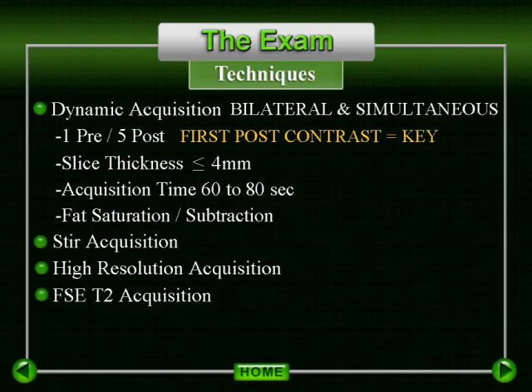We did encounter an isolated incidence of a mucinous cancer, which on T2-weighted imaging appeared to demonstrate a classic reniform configuration with a central hyperintense hilum of what we assumed was fat. In reality, this appears to have been related to mucin or other T2 hyperintense material centrally within the tumor. Immediately following this case, we subsequently began orthogonal high-resolution imaging with fast-spin echo T1-weighted, non-fat saturated pulse sequences. We do still utilize one sequence of T2-weighted imaging, either with or without fat saturation.